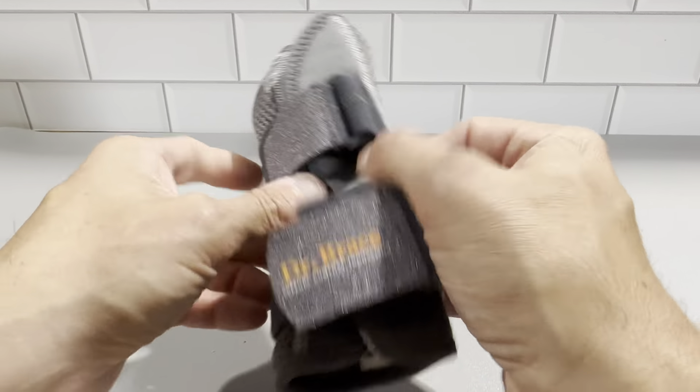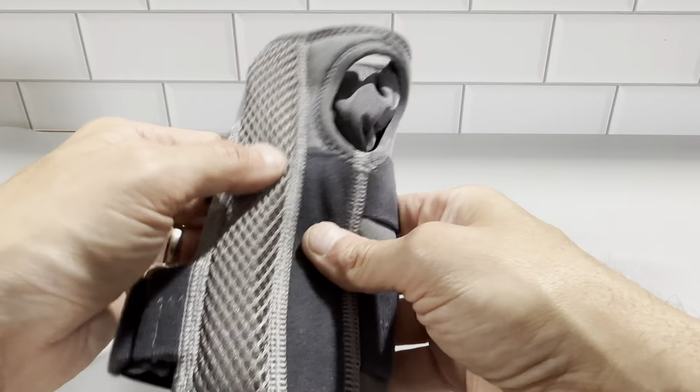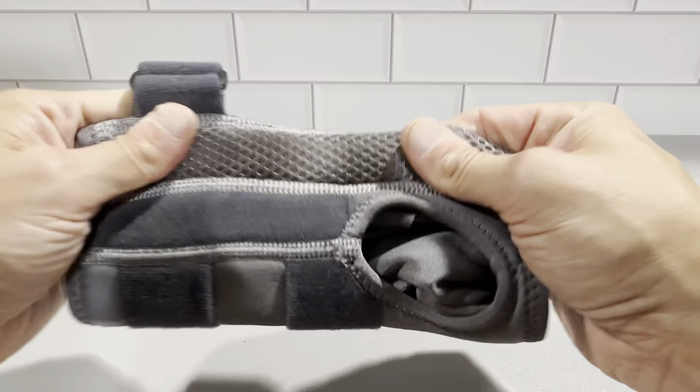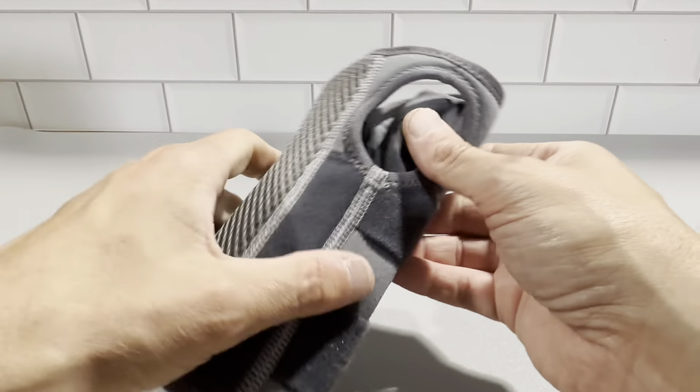This is made to wear overnight so you can just stay comfortable. This area here keeps it straight and there's just a little bit of flexibility, but it's still going to hold your wrist straight.